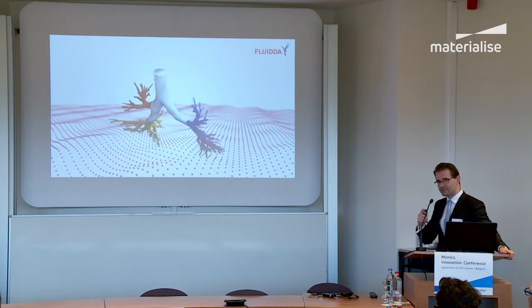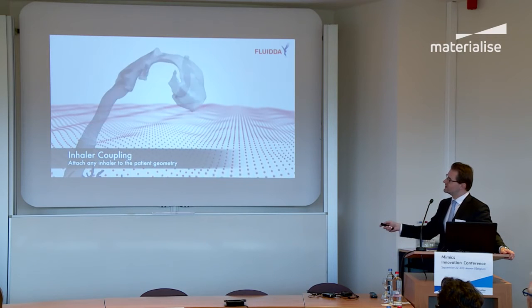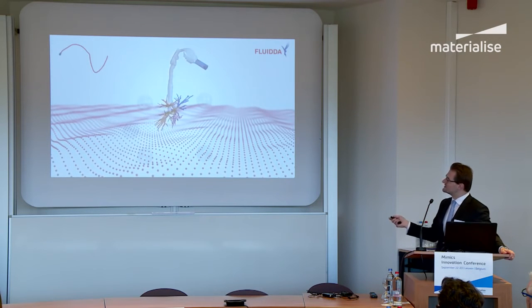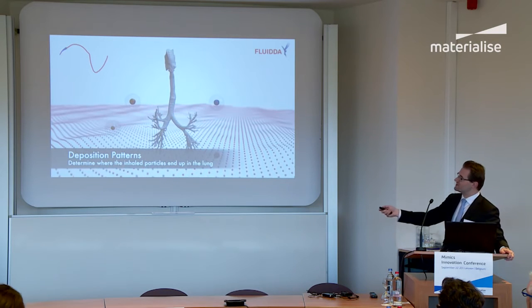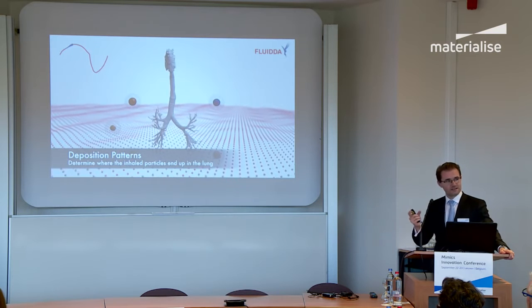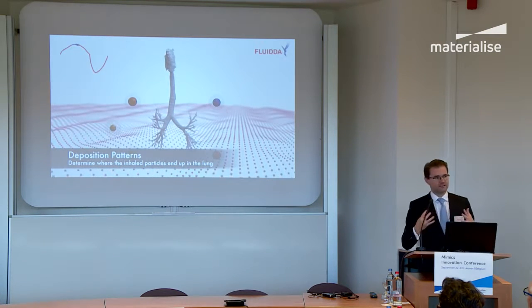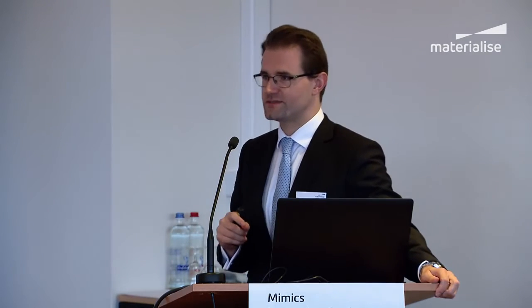If we treat the patients with inhalation medication, like these inhalers, we can also see where the particles end up. Therefore, we attach the patient-specific upper airway. On the computer, we connect the device, and then we simulate the flow, and we simulate the particle behavior based on the patient-specific inhalation profile, the particle characteristics, the size, etc., the airway geometry, such that you end up with an effective exposure, a regional effective exposure of an individual patient.